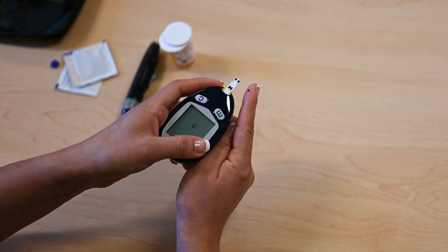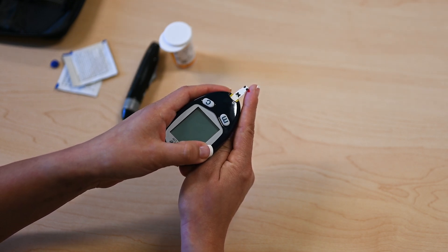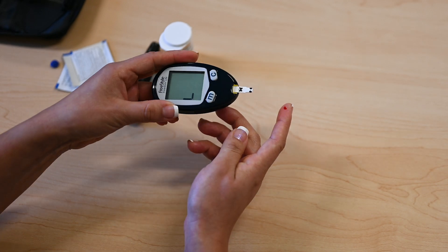Put the test strip up against the blood drop. The meter should then show you your blood glucose number.